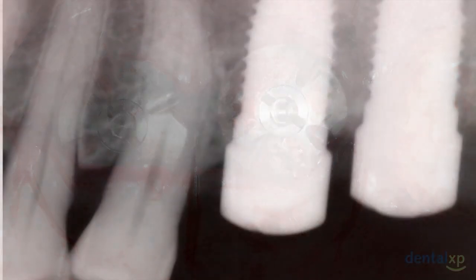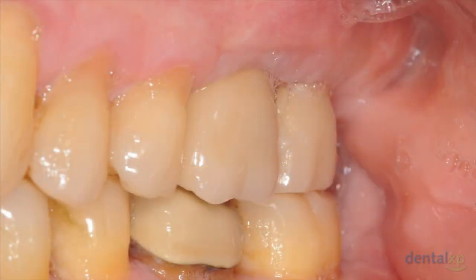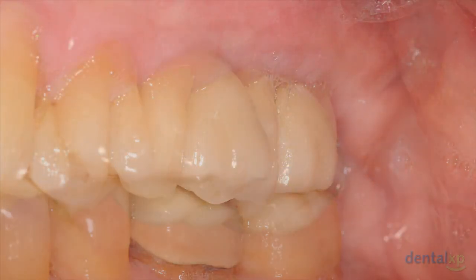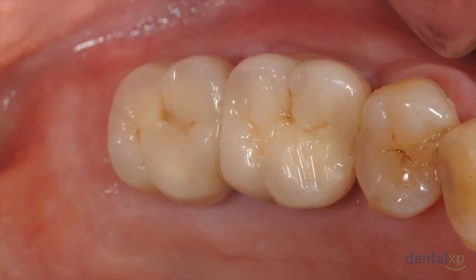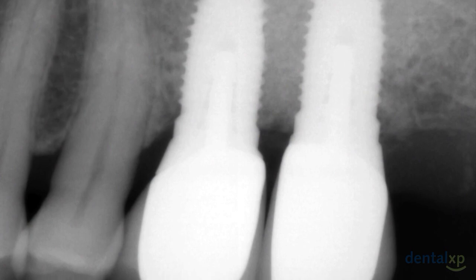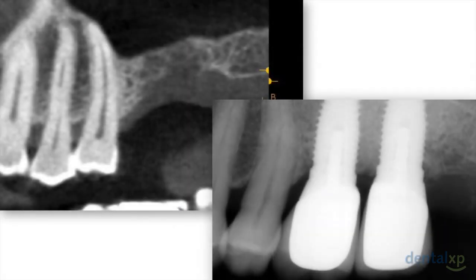So here are our implants with a more ideal positioning at the crest, well aligned with our plane of occlusion and the adjacent teeth. And the final restorations with proper crown length and tissue level for improved function, stability, and access for an effective hygiene. The bidirectional maxillary bone augmentation for this type of defect allows ideal placement of dental implants with a more favorable crown to implant ratio, as well as improved aesthetics, function, access for hygiene, and longevity.